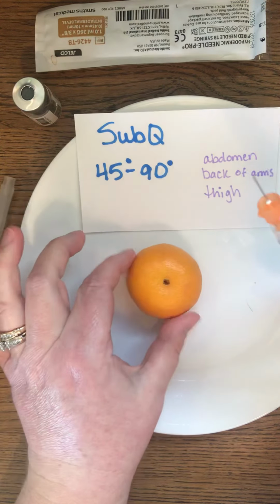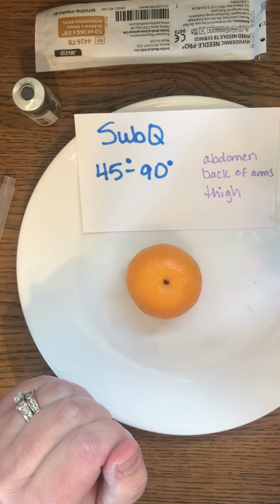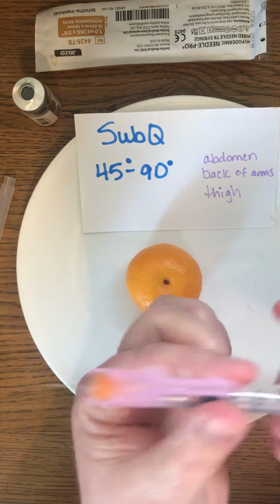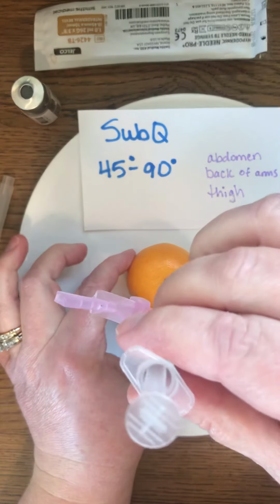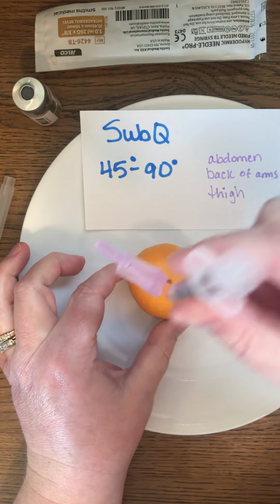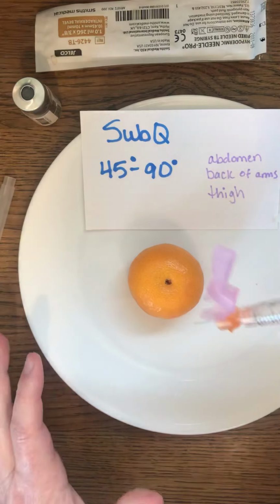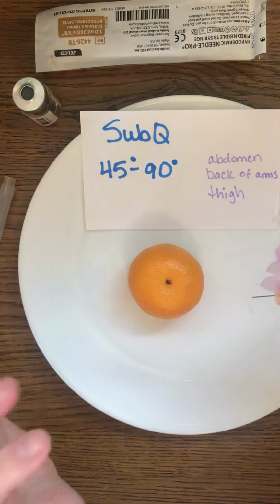So again, it's going to depend on the person in front of you, but we're either going to go in at a 90-degree angle or a 45, somewhere in that range. So again, 90 is going to be just straight up and down, and then 45 is going to be that cut in half. Okay, so I'm going to just demonstrate a 45 since it'll be easier for you to see on the video. So again, with this, we probably are going to want to pinch the skin a little bit.